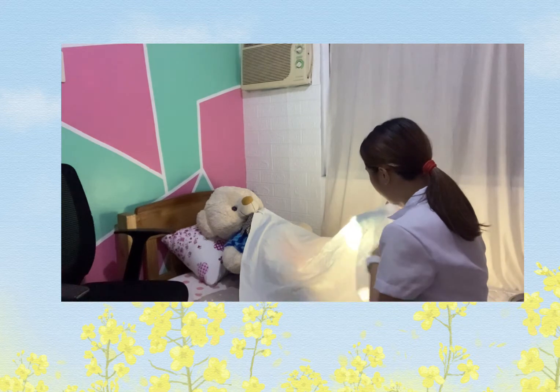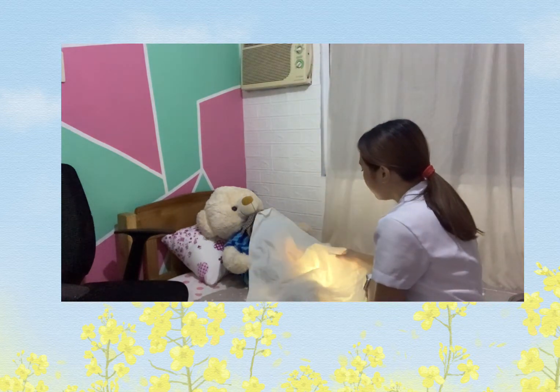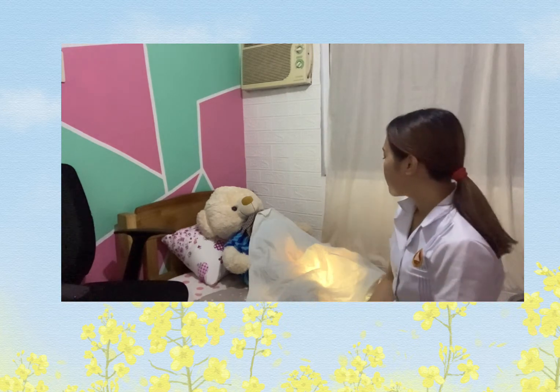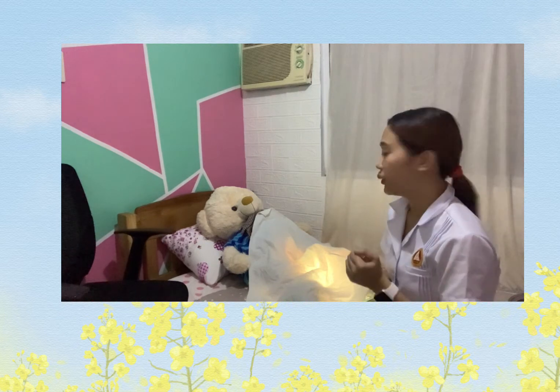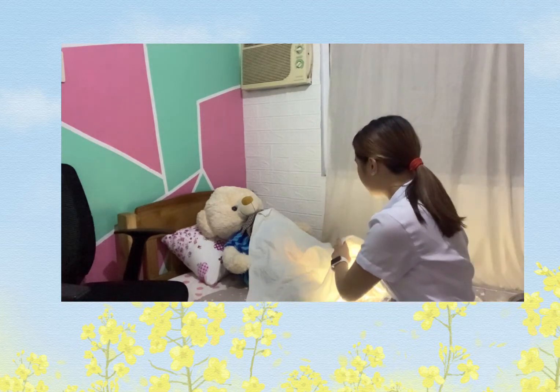And then, we need to make sure that we regularly assess or check our patient if there are any irritations, burnings, or untoward reactions. Assume that 15 minutes is already done, as per doctor's order for the duration of the therapy. Now is the time for us to remove the Perilite under the blanket.